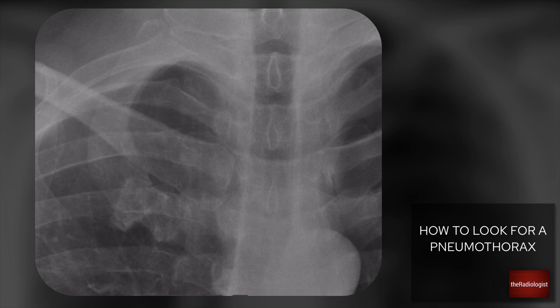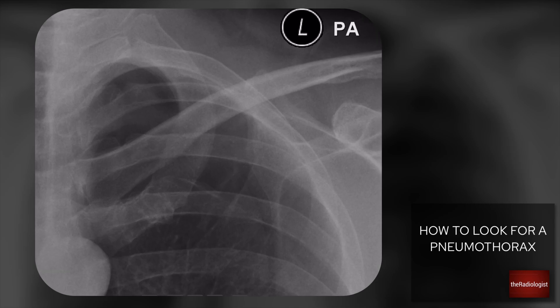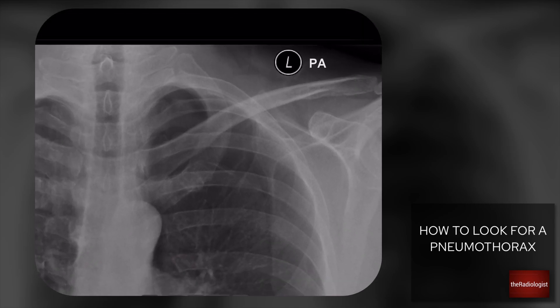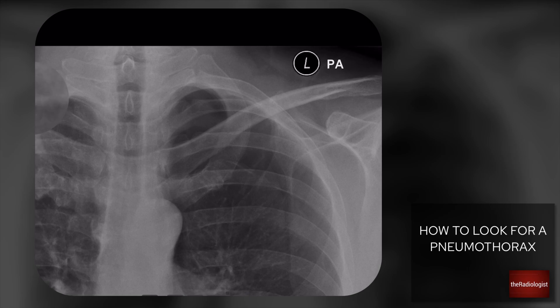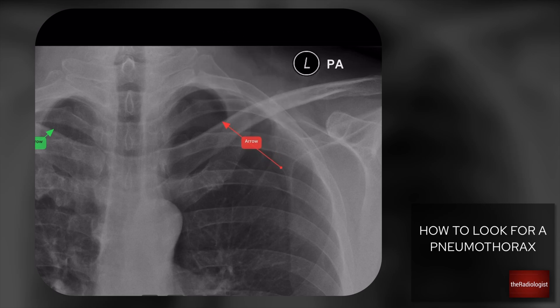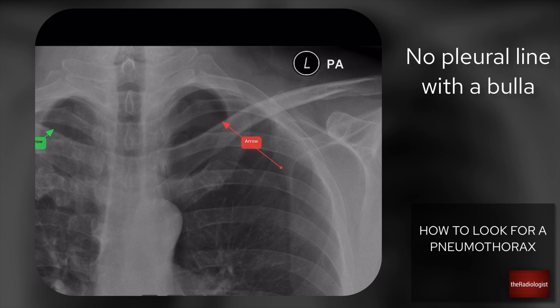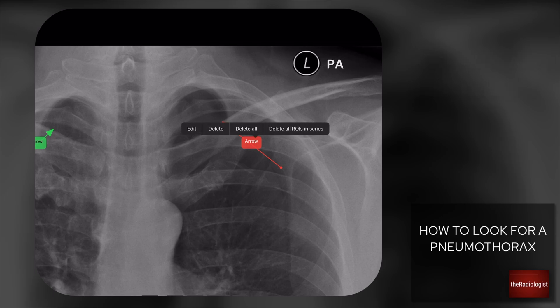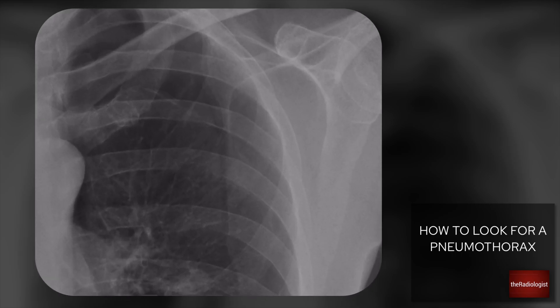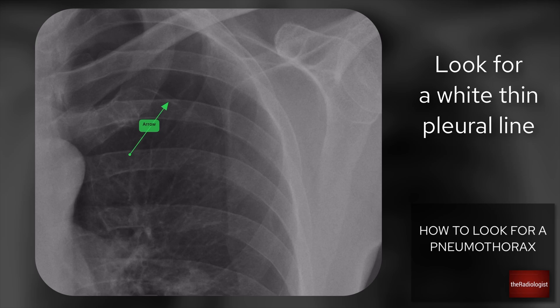Now let's look at the other side. Are there lung markings here? If you're not sure, compare to the other side — I can see lung markings on the right but over here there's nothing, so you have to suspect a pneumothorax. One differential is bullae in the context of emphysema, which can give a similar lucency. However, with emphysema you won't get a pleural line paralleling the chest wall — the bullae appear more circular. Looking a bit lower down, I think we can just about make out a thin white line that you can follow all the way down.